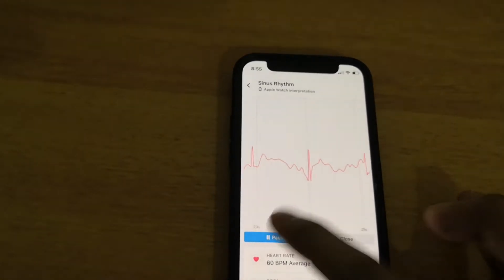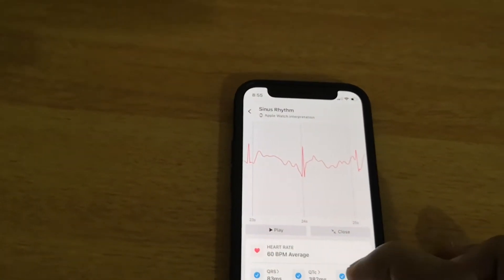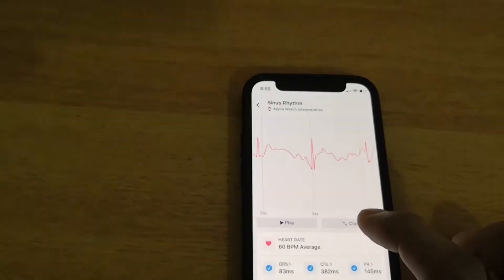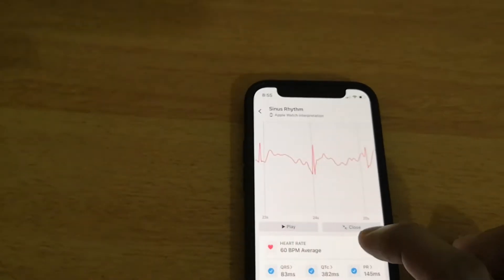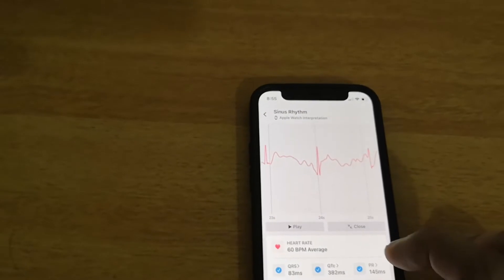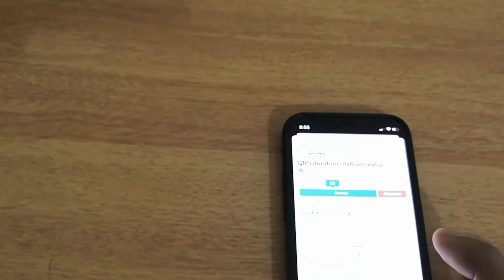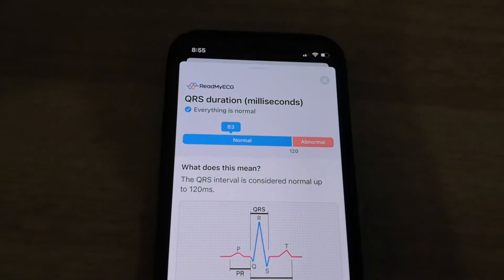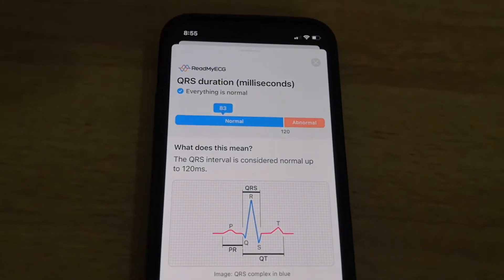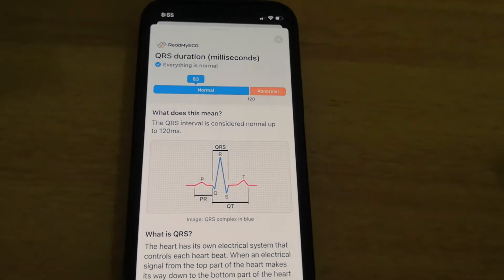Heart rate you get from the normal Apple app as well — 60 beats per minute in my case. The app also shows you QRS, QTC, and PR values, and indicates whether each is normal or not. My QRS is around 83, and if it is more than 120 it is considered abnormal.